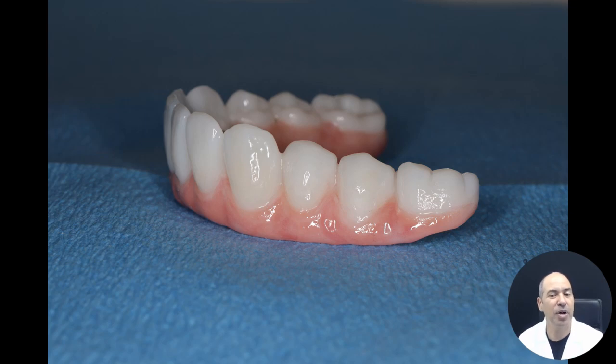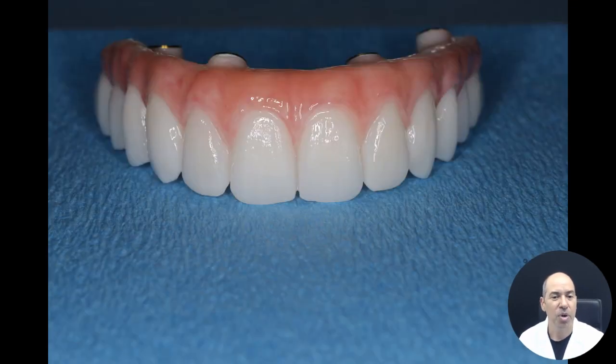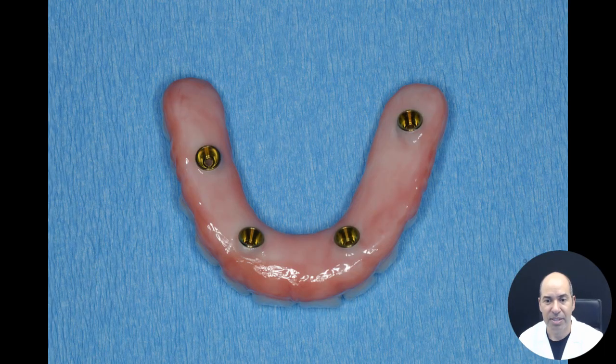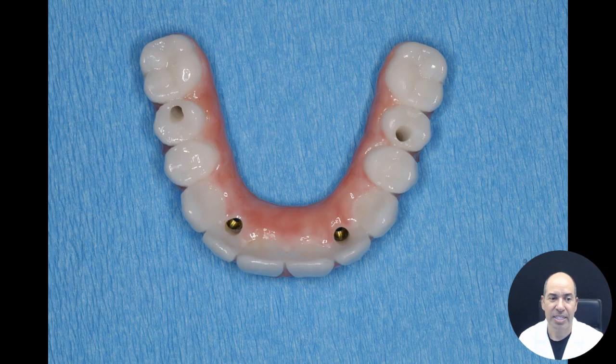These are final zirconia bridges. All the rest before were plastic, okay? You don't want plastic as a final. You don't want plastic fused to metal. Those just break. So you can see the beautiful aesthetics, the pink, the surface underneath where you're going to water pick and where you're going to floss. It is smooth, highly polished, and easy to clean.